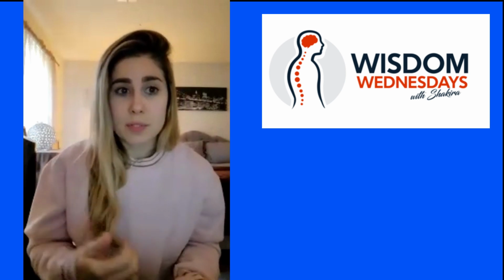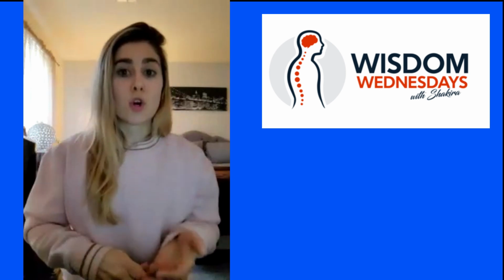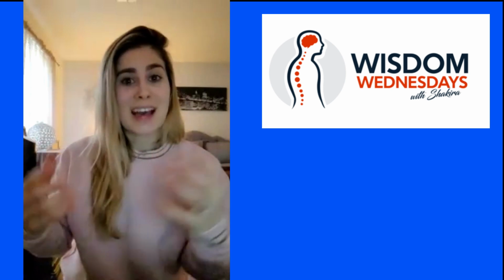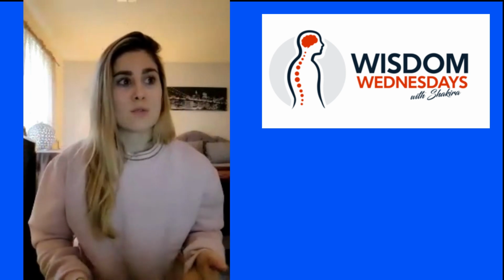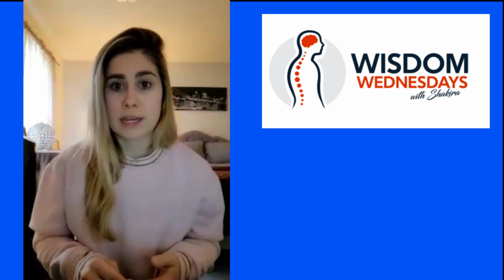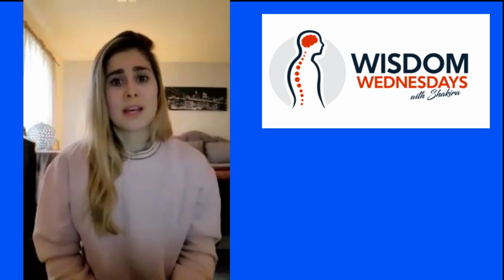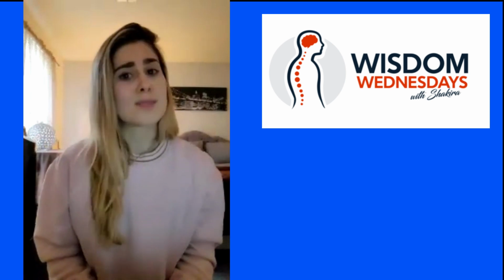Know the anatomy, the procedure, the MRI, knowing all of the things of what you could expect and what you should expect and what anything in between could occur. Having all of this information is so important. So that's why you look at the MRI. You know the patient information, you know their background, you've looked at the chart. All of these things allow you to put the puzzle together really easily. So if after checking through all of those things the alert is still present, then it's probably a real event, right?